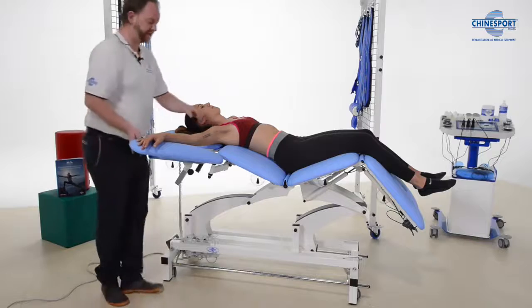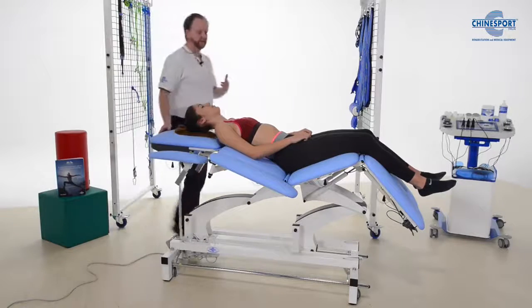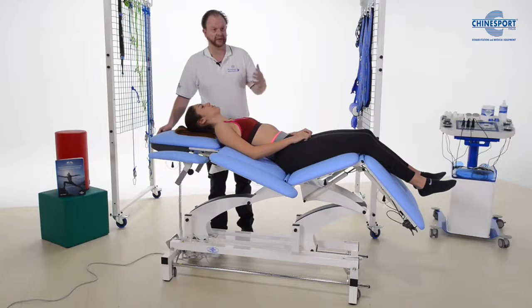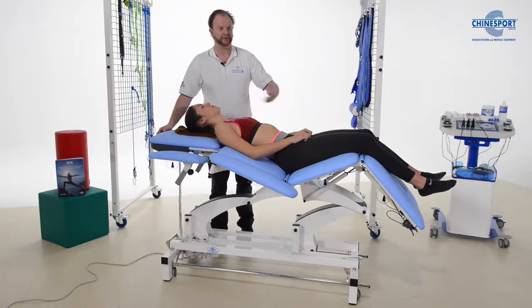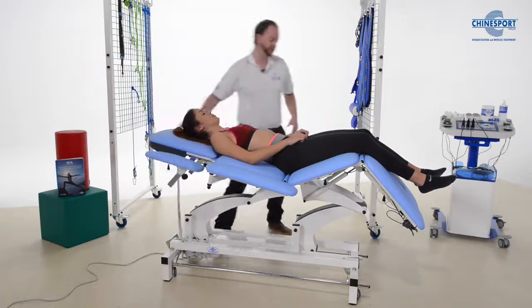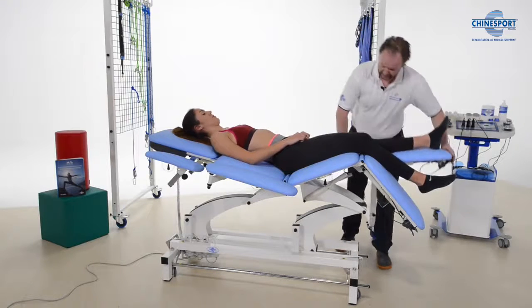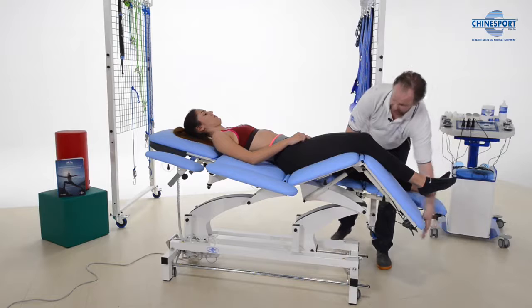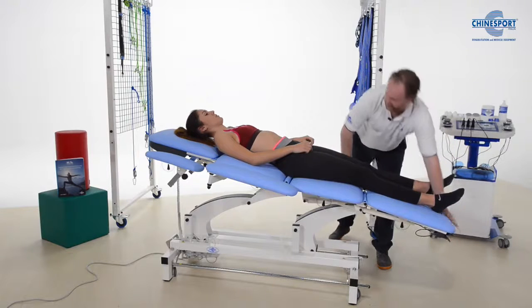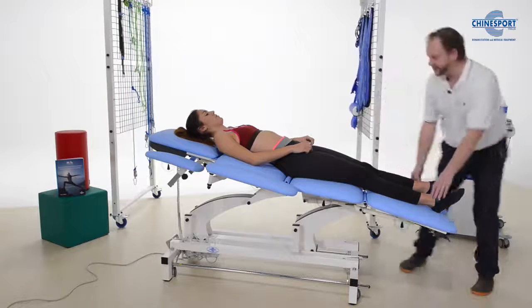And then we can bring the patient back. This would take a few minutes just in the practice. And as you know, the diaphragm is connected to the spine, so it kind of gives a natural traction to the spine. And when we're talking about traction, what we can also do is, as the patient is more able to lie flat, we can provide some kind of traction here through the legs.